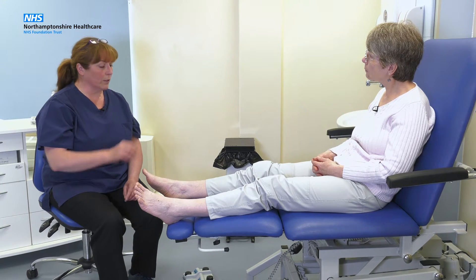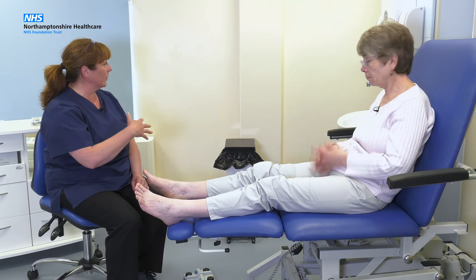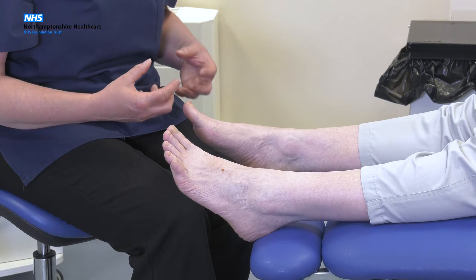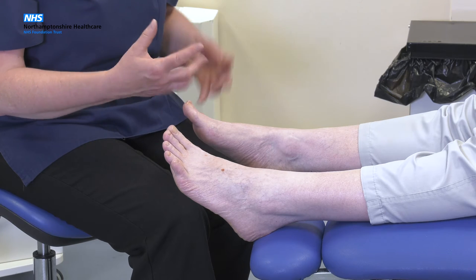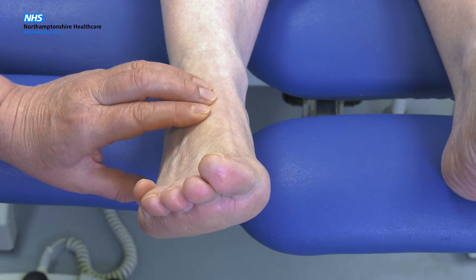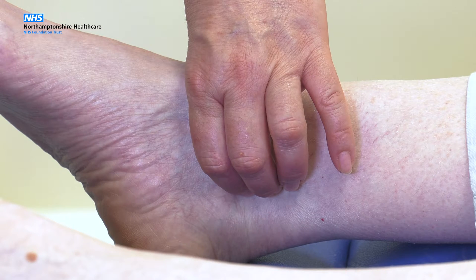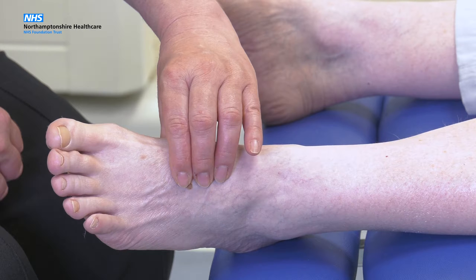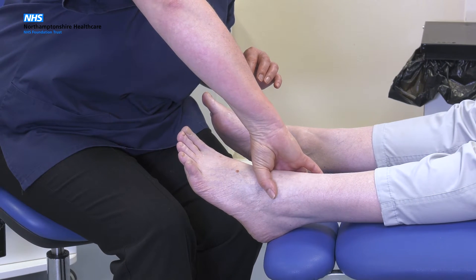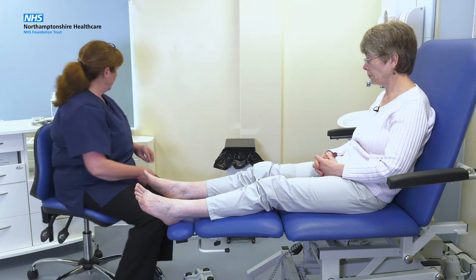Now, Lisa, we're going to do an examination of the blood flow to your feet. We call this a vascular assessment. I'm going to be feeling the pulses and then using a little machine that we can listen to the pulse sounds and see how healthy the blood vessels are. What we're looking for is a nice healthy blood flow so that if you did have any problems with wounds or injuries, they would have a good chance of healing quickly. You've got two pulses in your foot — one on the top of the foot, which we call the dorsalis pedis, and one around the ankle, which we call the posterior tibial pulse. They feel quite healthy to me, and I can see from the nice healthy pink colour of your skin that generally the tissues look quite well perfused. So we'll move on to the Doppler.